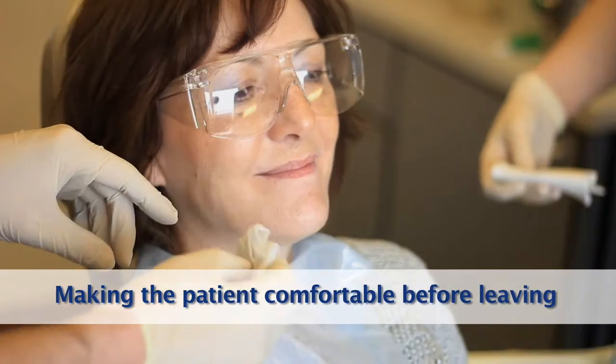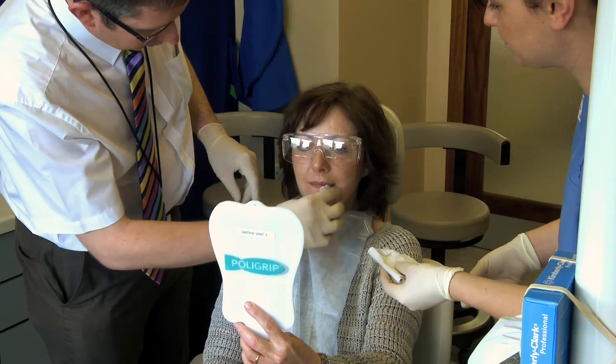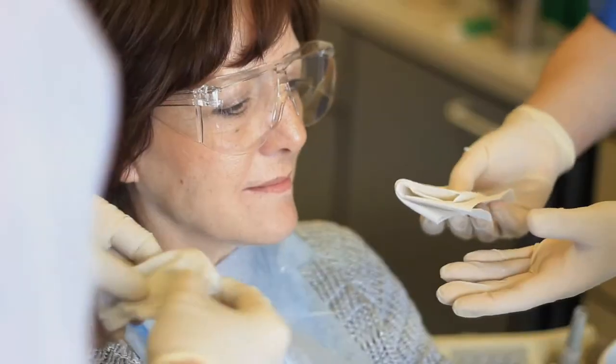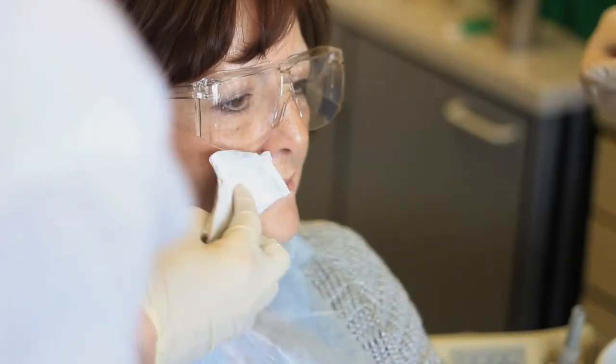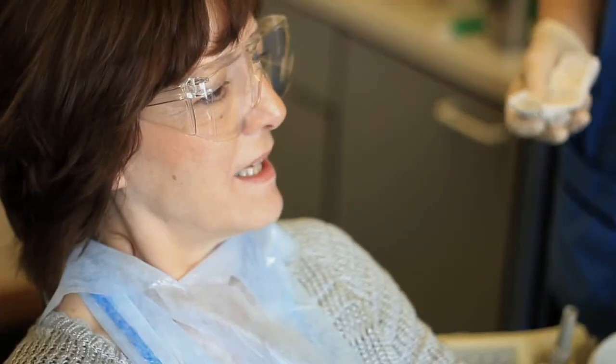Okay, thank you. So we're just going to clean you up now. So the nurse has got a mirror for you. We're just going to clean any excess off the corner of your mouth, and then there's a dry tissue just to dry you off again. Okay, thank you very much. Thank you.